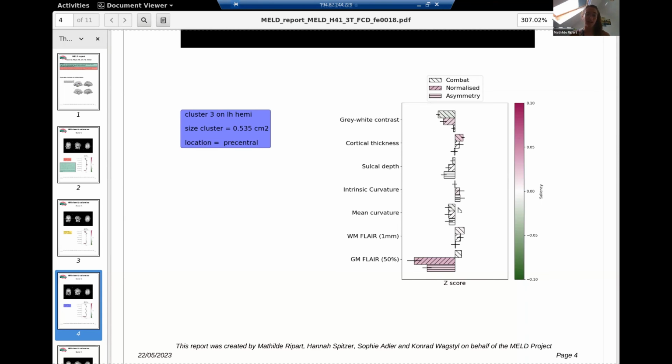One way to tackle this is to open Freeview and open the prediction, the T1, the pial and the white surfaces, for example, and look if there is any abnormality or segmentation error where your predictions are. And Konrad, I think you showed it, but I'll show it one more time. If you stop sharing, I can share again. So there is a script for doing that to check this.